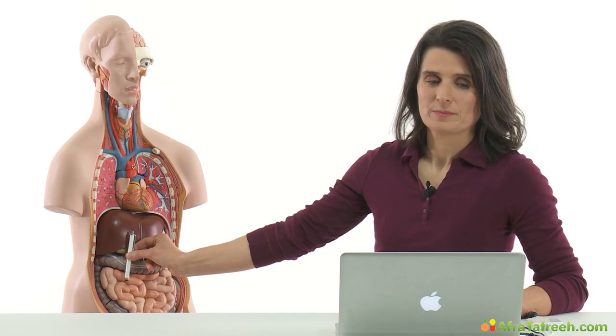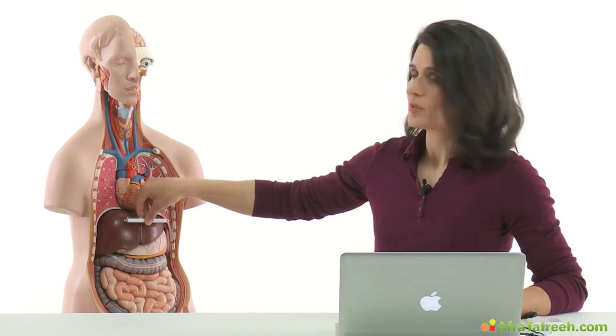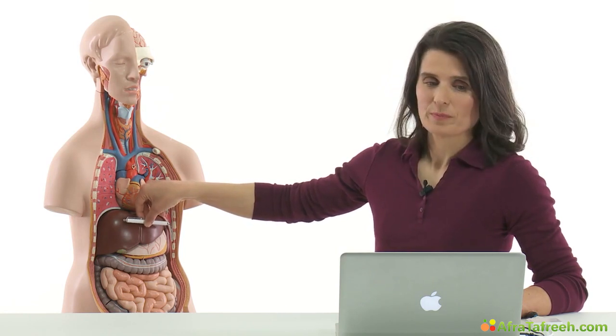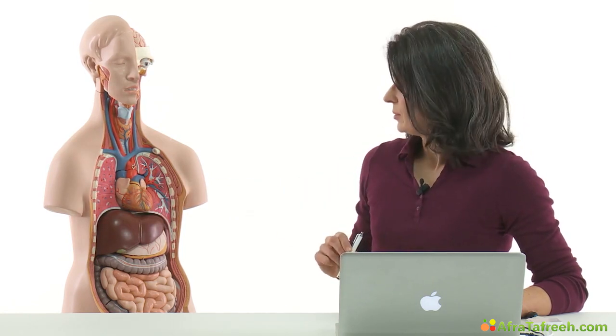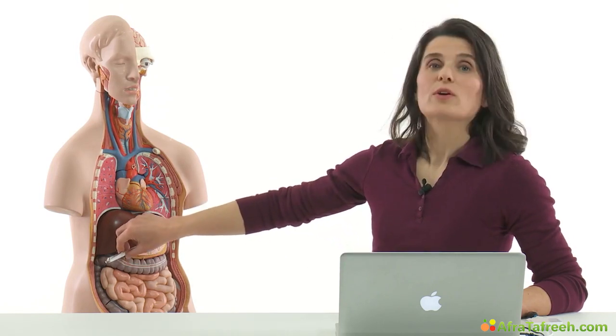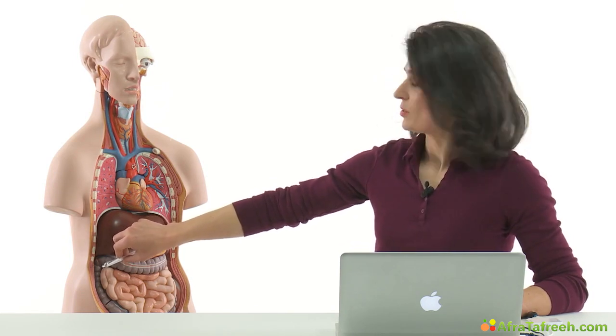Here we place the transducer below the costal arch and have to tilt upwards to get a good view of the liver. Next, we perform a transverse view, also in the epigastrium over here. Put the transducer in a transverse position. We can also assess the left liver lobe. The next view is an oblique view, below the costal margin again, but this time in an oblique position. Also, we have to tilt the transducer steeply upwards to get a good picture.